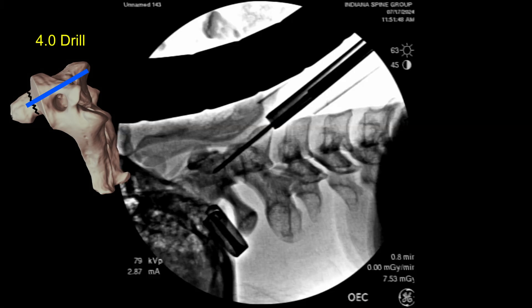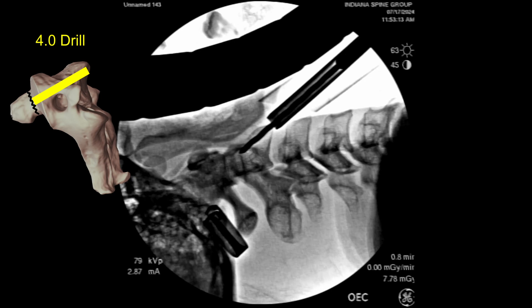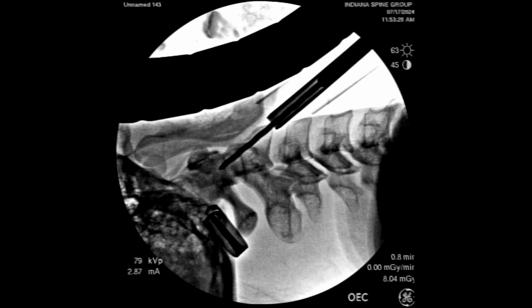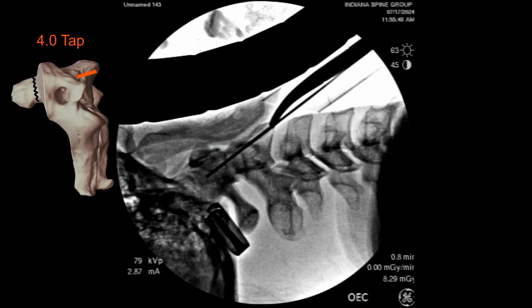We're now switching to our 4.0 drill bit, where we're going to drill the near side of C2 all the way up to the fracture so that our fully threaded screw will slide through that portion before engaging the far side. We advance the 4.0 drill bit on the lateral just up to the fracture site but not past it. We'll use a K-wire to measure our screw depth — it's going to be a 42mm screw — and then advance the 4.0 tap across the fracture site into the hard cortical bone of the dens for appropriate screw purchase on the distal fracture fragment.